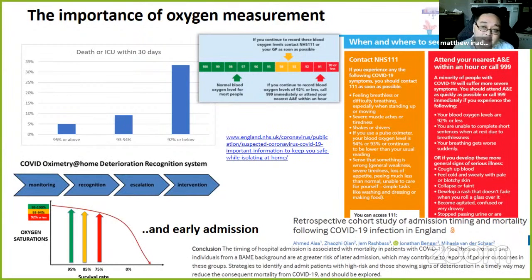And if you're in a 93 to 94% grade, you contact for help. You look for help as a patient, either through 111 services, your GP, or your COVID virtual ward in secondary care. And that normal is defined as being in an oxygen level of 95 to 100.